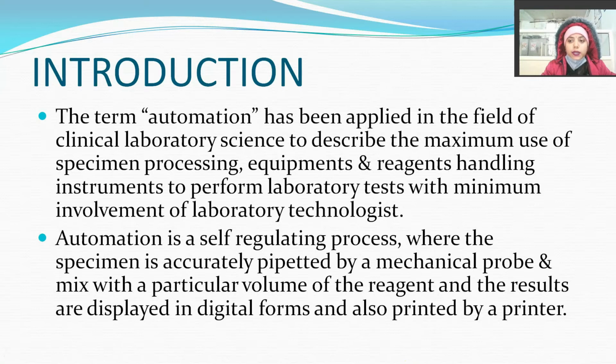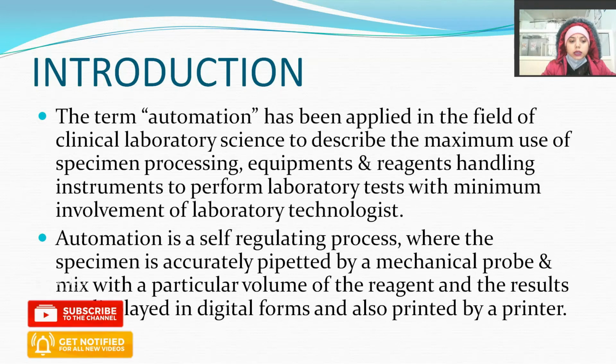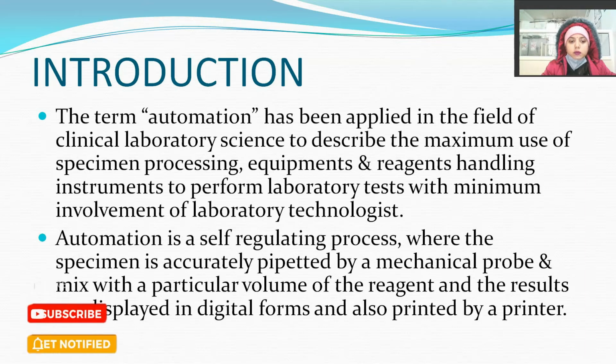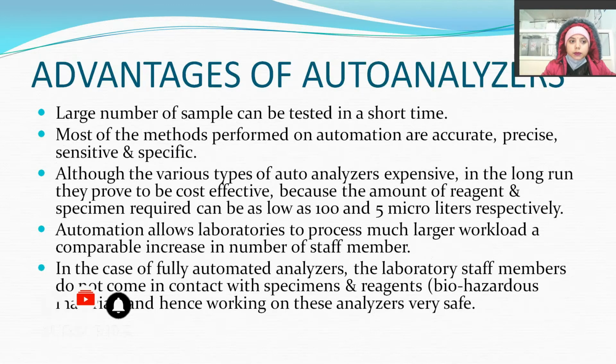involvement of laboratory technologists. Then, automation is a self-regulating process where the specimen is accurately pipetted by a mechanical probe and mixed with a particular volume of the reagent, and the results are displayed in digital form and also printed by a printer. Now, these are the advantages of the auto analyzers.